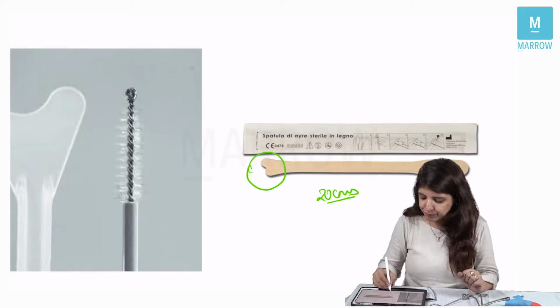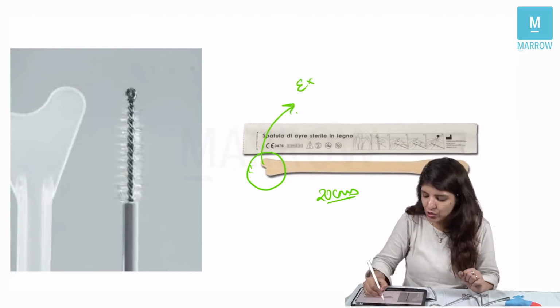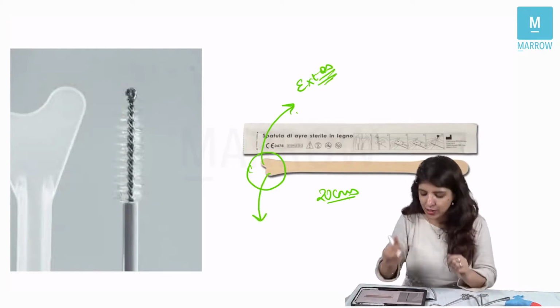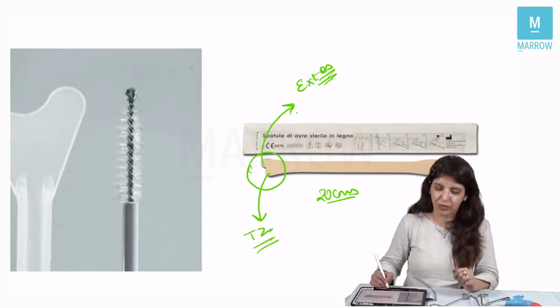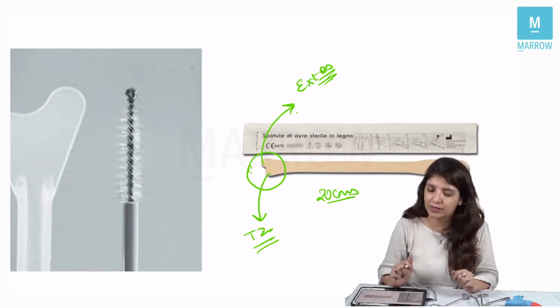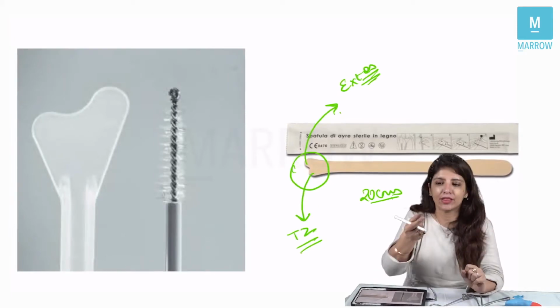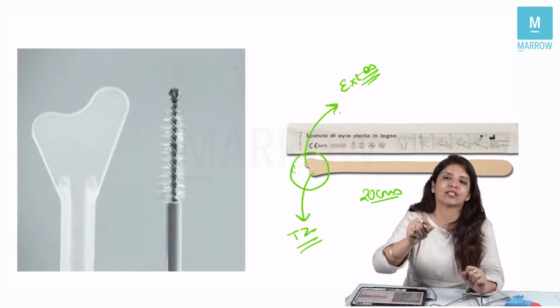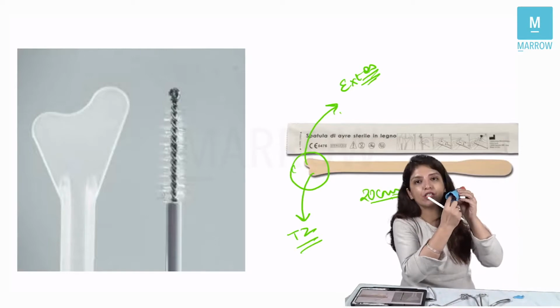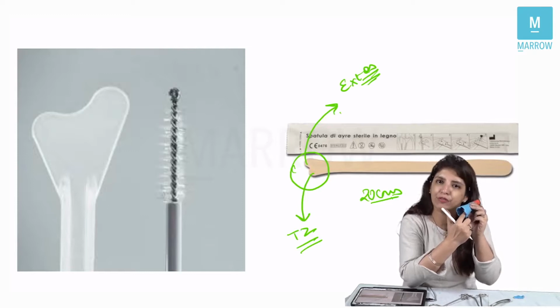In this case, the longer limb of the bifid end is going to be on the external os, and the smaller bifid end you are going to put on the transformation zone, right? So the slightly longer side is put on the external os, and the slightly smaller side on the transformation zone, and then you rotate it through 360 degrees. When you rotate it through the entire 360 degrees for 2 to 3 times, the entire transformation zone would be covered, right?